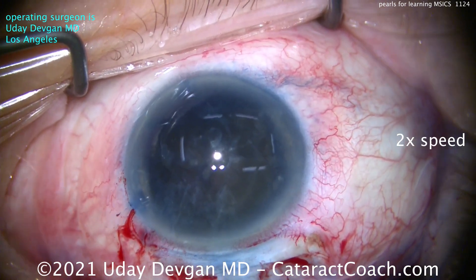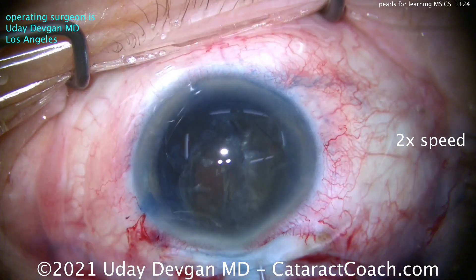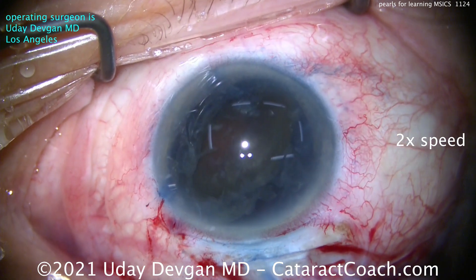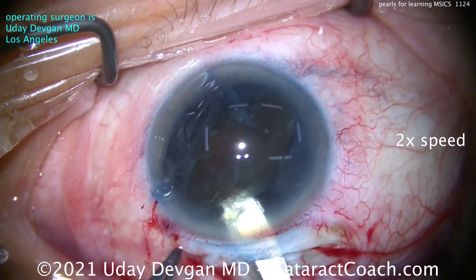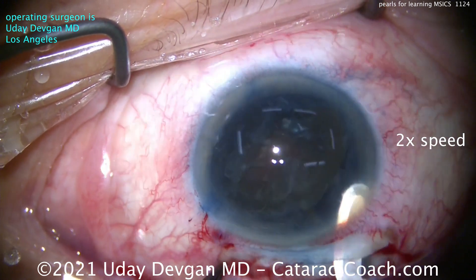Now we've got the full nucleus available above the capsular rim and even above the iris. Apply more dispersive viscoelastic going under the nucleus and above it — very important. That dispersive viscoelastic needs to protect the corneal endothelium as well as the posterior capsule. Now we use our crescent to open the incision up to its full size.